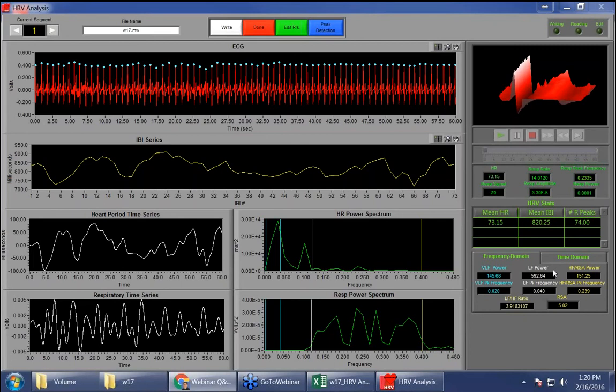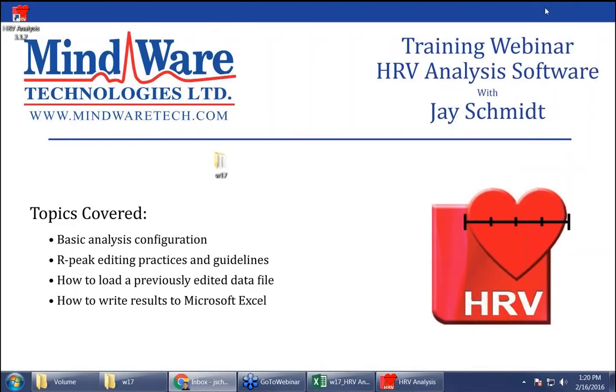Okay, we have about 10 minutes left here. So again, if anybody has any questions at all, please go ahead and send them in. And actually, while we're waiting for some more questions to be sent in, I'm going to go ahead and show you guys the support site knowledge base articles, just to show you kind of how that works.